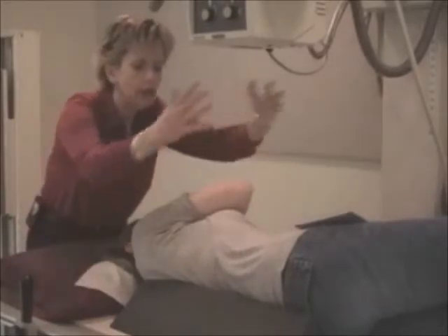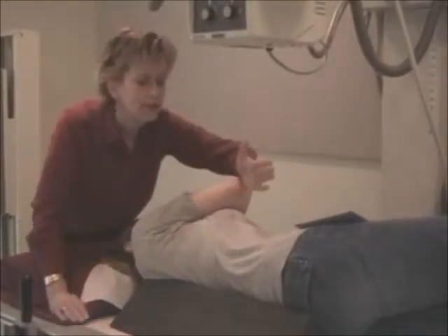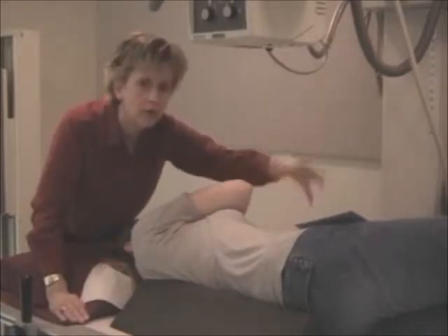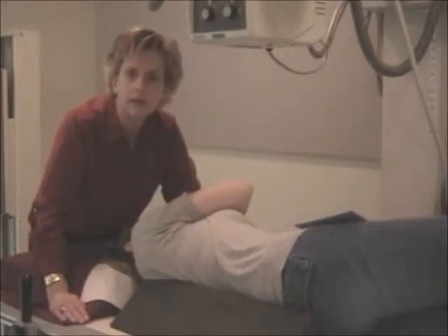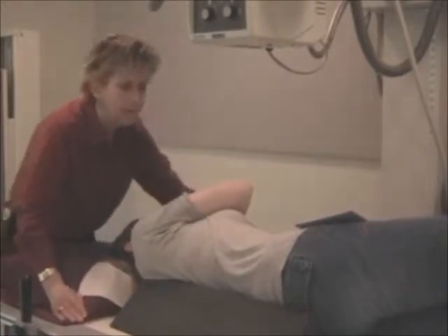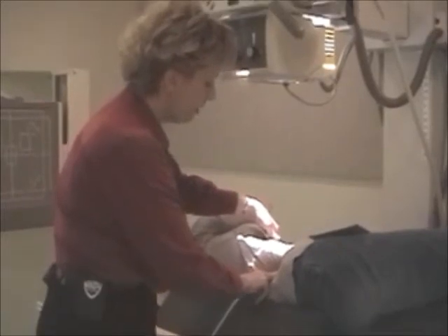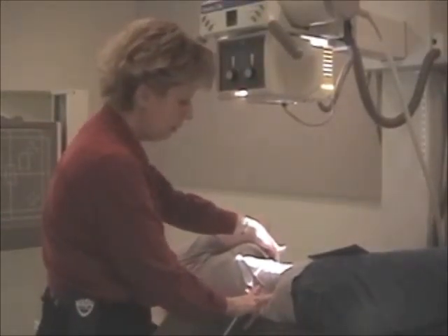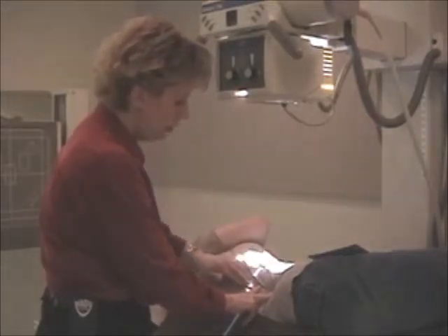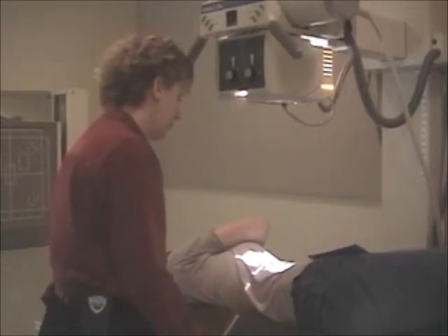Now, if a patient is really obese and the tissue falls this way, you're going to have to shift and be centered more over here. Okay? Again, you have to use some logic in finding the stomach side to side. I've centered her body, and I am 2 inches below the xiphoid. Again, that's approximately the level of L1 or L2. Here's the crest. 2 inches above would be L3. So you can see I'm approximately L2. So I'm happy with that centering.